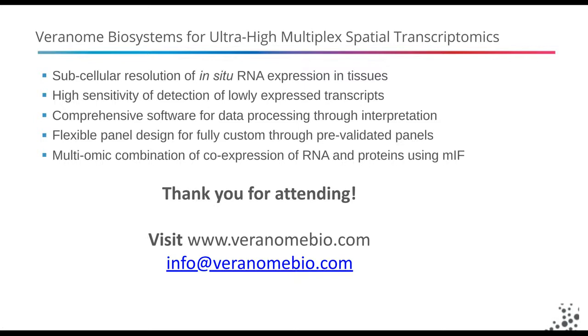And then on the image area, as you saw from one of my slides, we're starting with pieces of tissue. I think you could have visualized pretty much the entire mouse brain, and then the overall area that you're imaging is going to be dependent on how much you want to see, so that's tunable to the researcher, and the number of plexi that you're looking at.